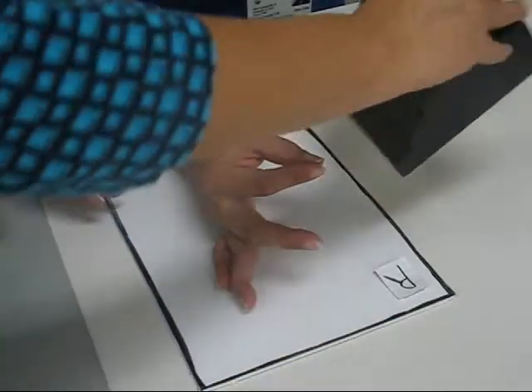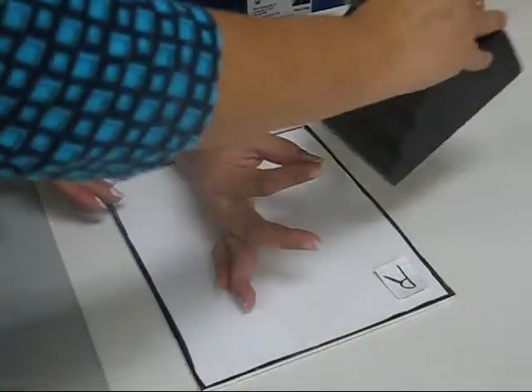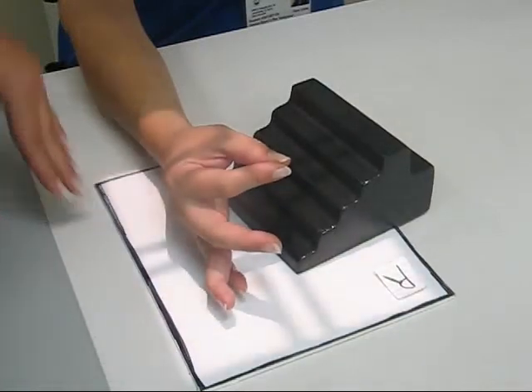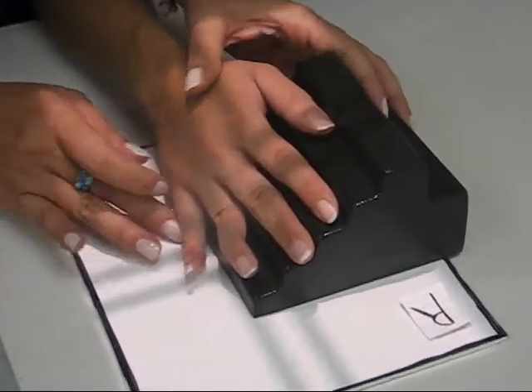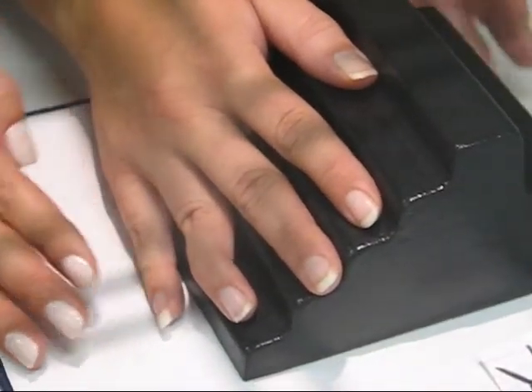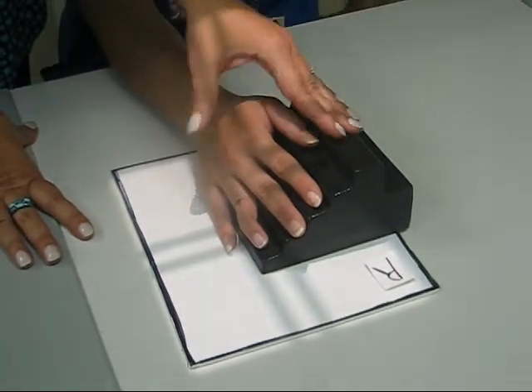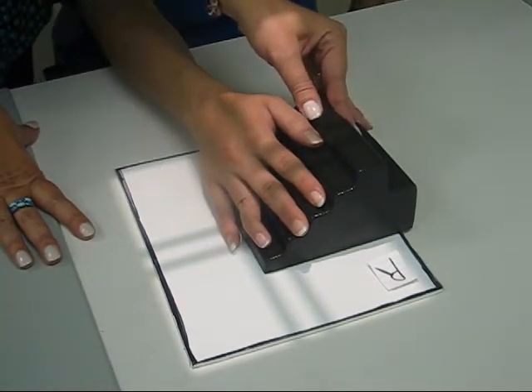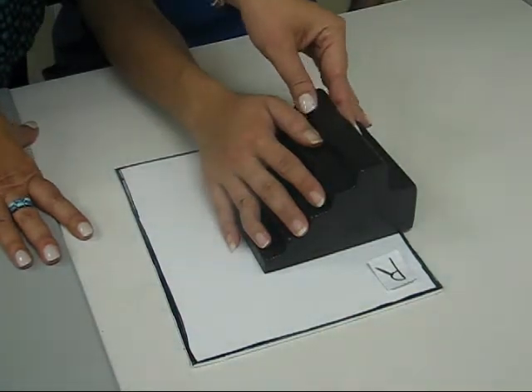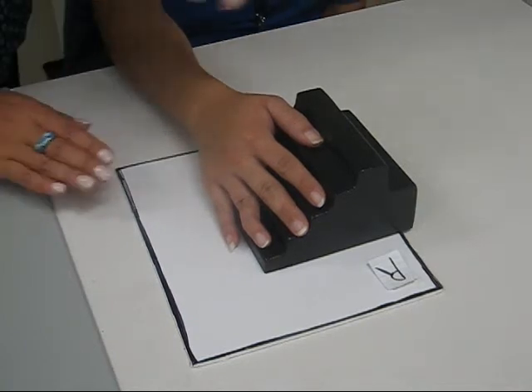If you were going to use the sponge, personally I very rarely use this. If anything, if I was going to use this, it would be for an oblique, because I don't believe that this gives you a true lateral of the fingers. So I would use that aid for an oblique, maybe of the hand.